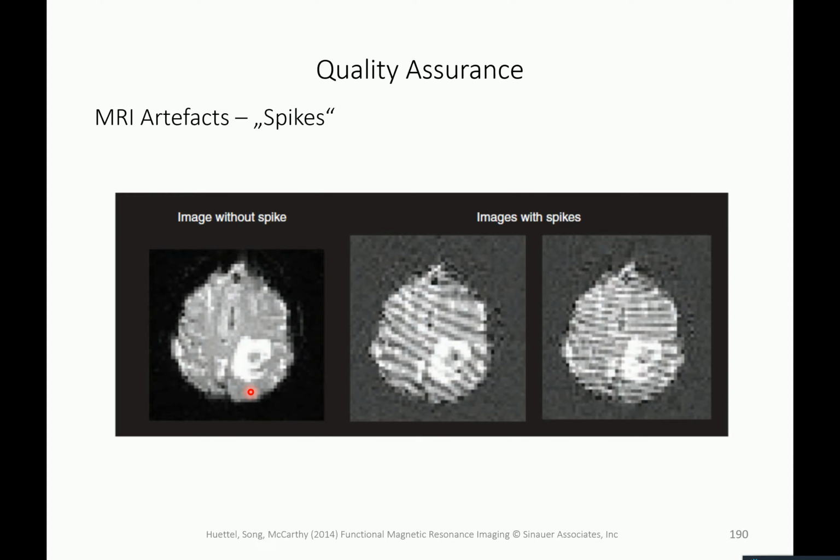So now going to detecting spikes in MR images, or different kinds of artifacts. This is an image which is fine, except that I don't know why they chose this image, there's quite a big tumor here, which is actually quite sad for the participant, but I think it's from the MR handbook, they use this image to demonstrate what a spike is. So this is a kind of normal image. A spike basically looks like this wave-like pattern in the data, so that you have these stripes.